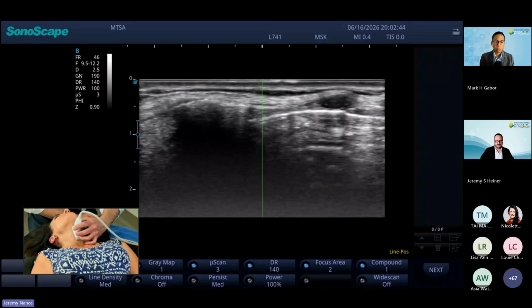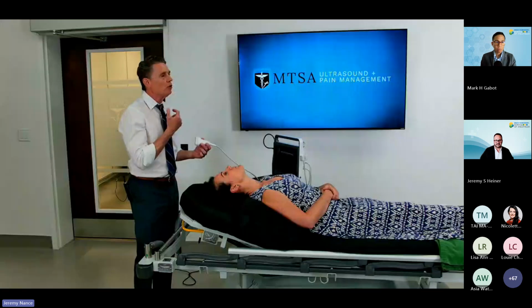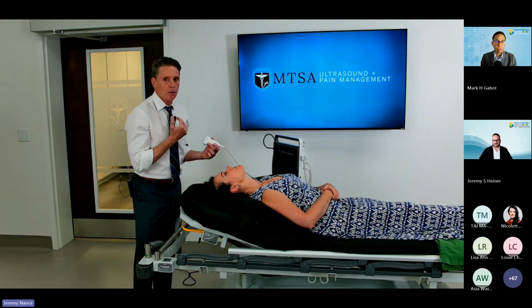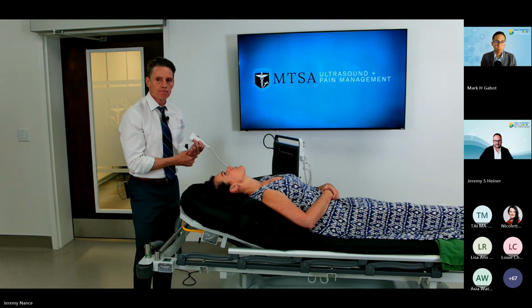And having done this, having done both the TACA and the string of pearls method, we have now not only found midline, but we can also see the inferior and superior borders of the cricothyroid membrane, and really drawing an intersection there, we know where the exact middle of that cricothyroid membrane is.